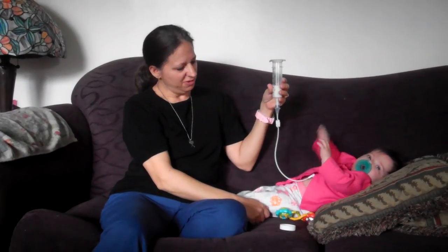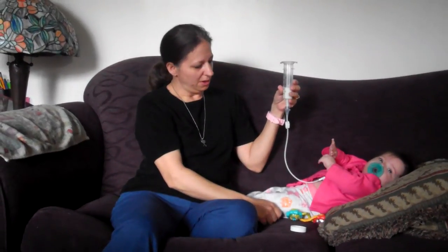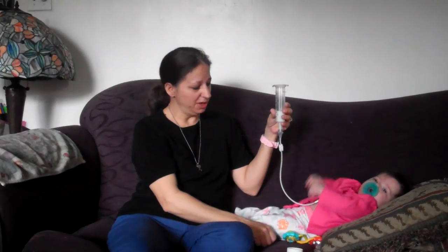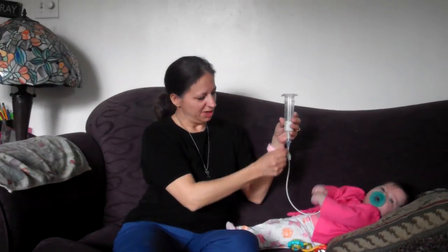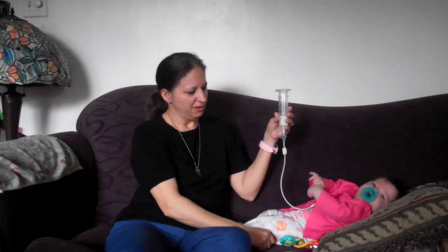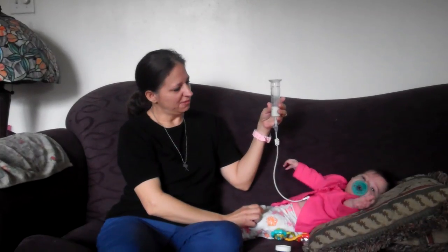And so also sometimes when she's eating, if I'm seeing a lot of gas or a lot of air come up through the tube from her tummy, I don't want that to go back into her tummy. So I will just clamp it, and I will unhook it, and I will prime it again. I will do what I did at the beginning, where I will just dump that air back in her bottle and make sure that we get her milk all through the tube, and then I'll just hook her back up. They say a little bit of air doesn't hurt them, but I don't want to put too much back in her belly. And so you just want to keep an eye on it.